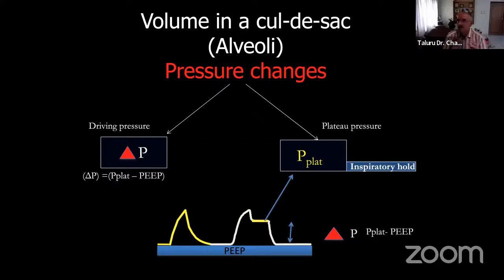Of all the alveoli that are open and communicating, not the collapsed ones, we are more worried about them because they are the normal alveoli. They are the alveoli which are participating in the gas exchange. In the ARDS situation, we would call that a baby lung. So if you don't safeguard the baby lung, you will have a good ABG and a dead patient. So remember that. Don't leave the lung protective parameters and go away. For a short time, you may have SpO2 of 99. I don't want a SpO2 of 99 when a patient is sick. I'm happy with 90. Because I know if I have to push more air, I'm going to overinflate my baby lung. So that is something you have to remember.